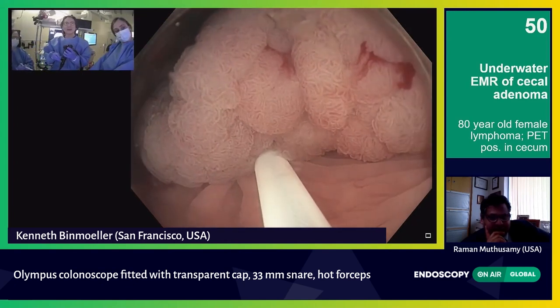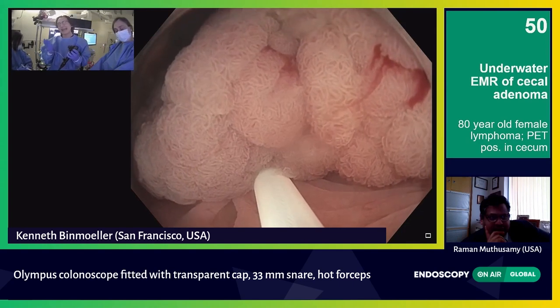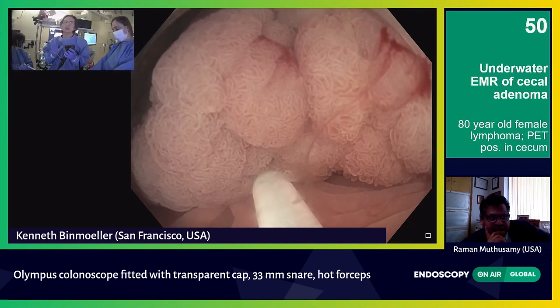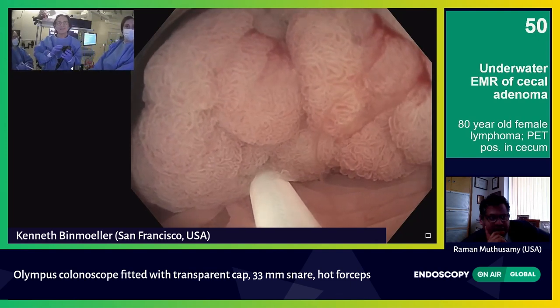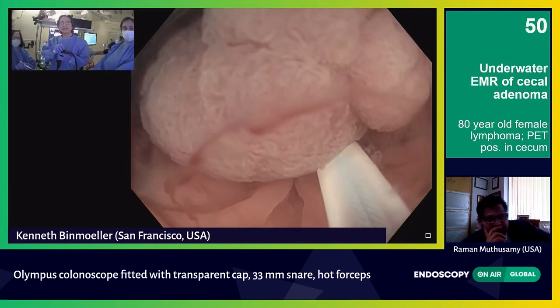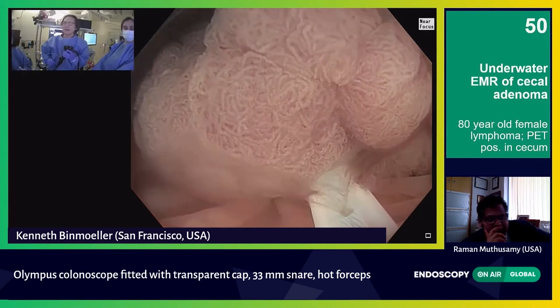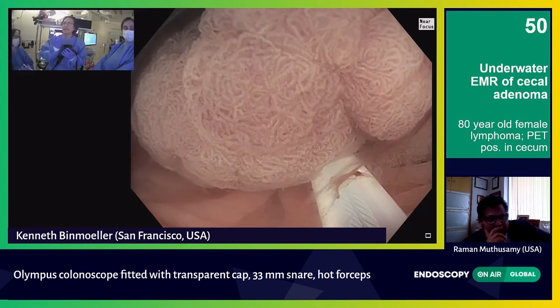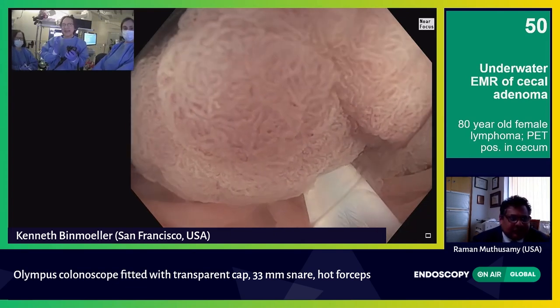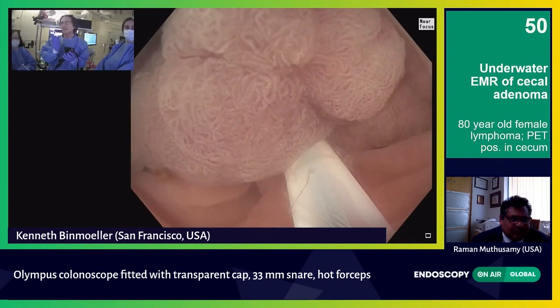We're ready to resect this. I'm debating — because this is very vascular and there's going to be bleeding — whether to start with some coagulation first, or just use coagulation. I'm actually going to switch to forced coag for this. We have the heat sink effect of underwater, and that limits the depth of thermal injury. We're in the cecum — it's thin here, but everything's contracted. We have maximum wall thickness preserved. The rationale for submucosal injection is to counter the effect of gas insufflation that distends and thins out the wall. So there is no submucosal injection here — we can preserve the native thickness of the cecum.